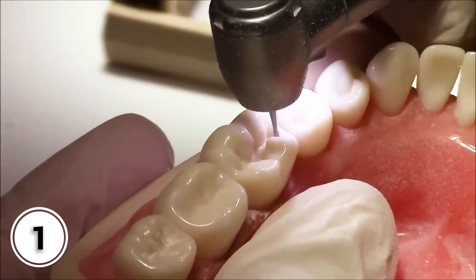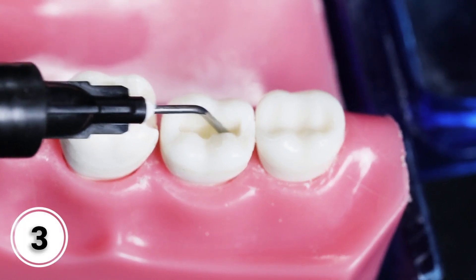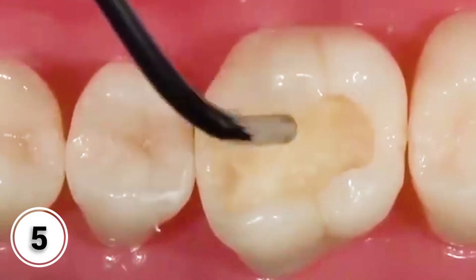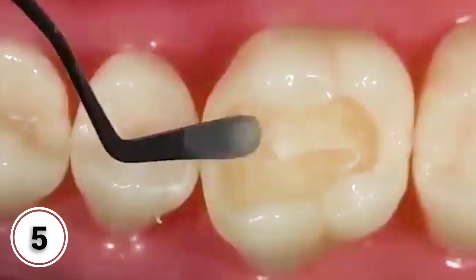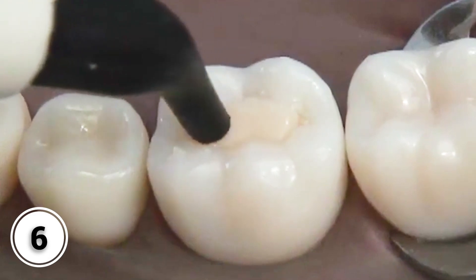Prepare the cavity and dry the surface. Attach the dispensing tip to the syringe. Apply a thin layer of Denticle LC paste on the desired area. Cure the material for 40 seconds. After curing, make any necessary adjustment or addition to ensure proper coverage and adhesion. Remove any excess material if needed. Proceed with the placement of the restorative material of choice.